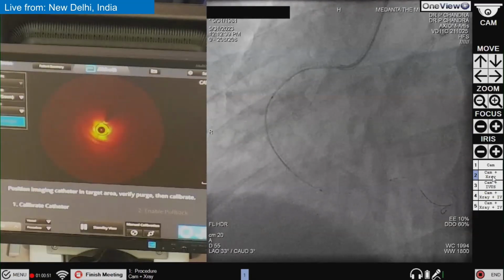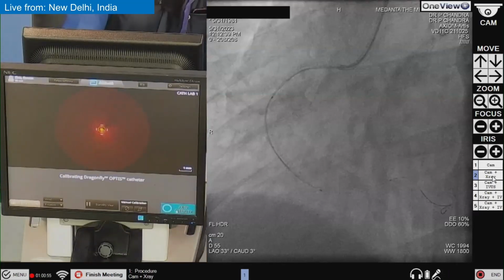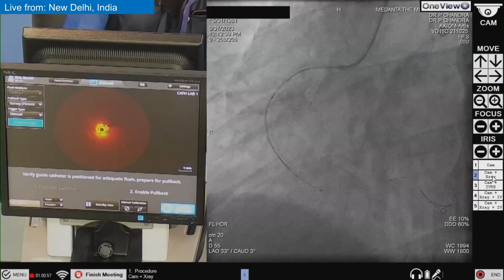Okay. You have to fill it. I will do it. So first I'll need to flush the lumen, so flushing the catheter lumen. Yeah. Again flush more. Oh, blood again. Okay, fine. So we'll flush the side lumen. Now we'll do the side port. Here it is. Side port. Okay.